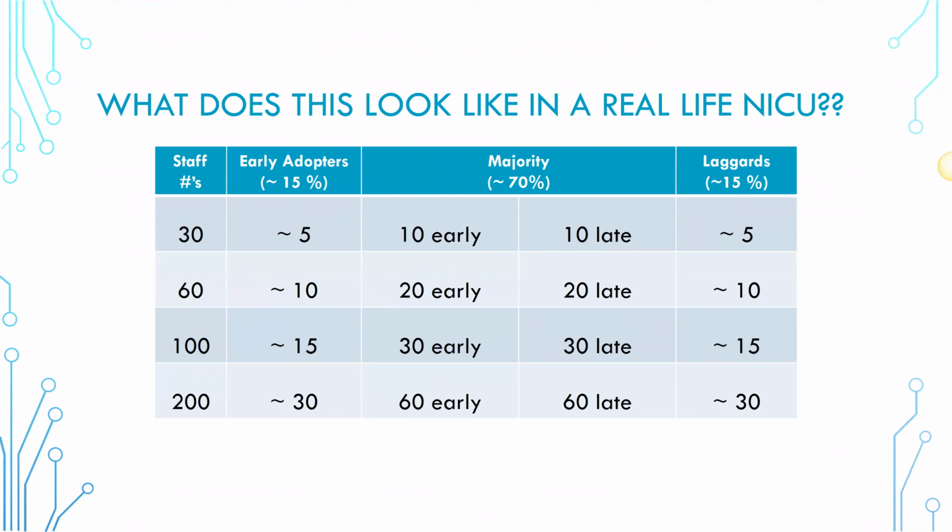So if you're going to do 100 cases, then you multiply that out. But I think the training costs are probably the biggest thing that people don't take into consideration for the budget, and then the device itself. Other than that, there's probably not a lot of other costs.